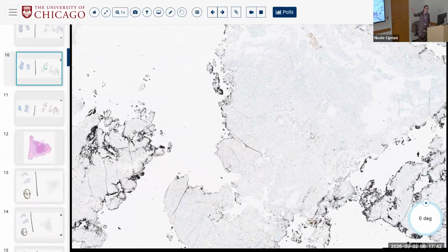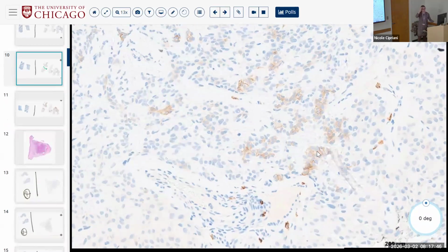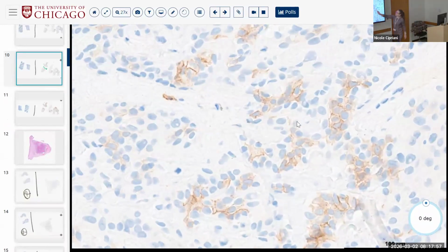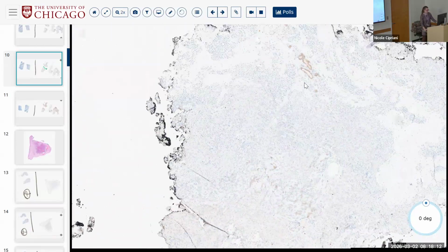And when you throw your CD117 on to see in contrast if there are epithelial cells, we're gonna go to that same area where we saw the myoepithelial cells, and we'll say, okay, in fact, there are tightly packed clusters of what look like possibly luminal epithelial cells, right? And you might be able to imagine that the negative cells out here might have been those P40 positive ones. Unfortunately, we don't have the overlay, but we have at least a c-KIT positive population and a c-KIT negative population.